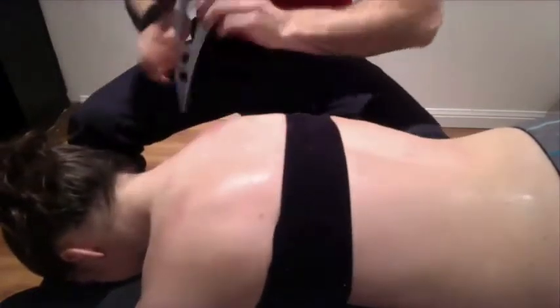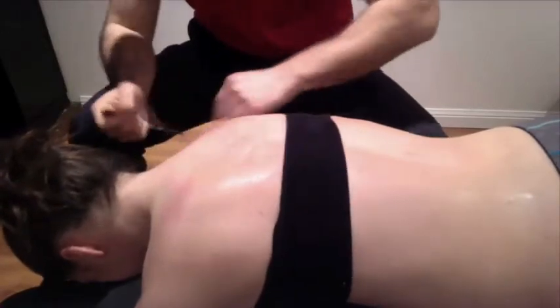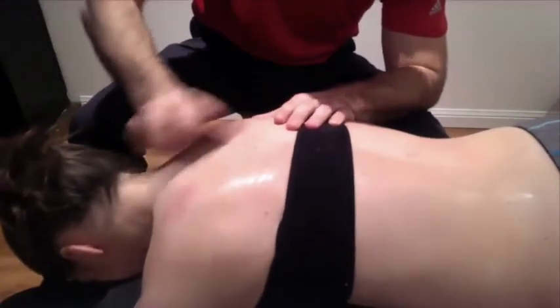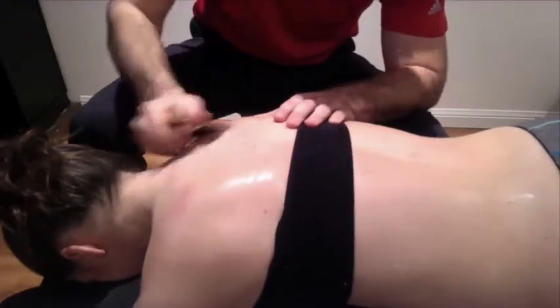Right up in through these traps and levators, we have a couple of nodules. So we're going to start off very broadly and work through those before we end up getting a little bit deeper. We're still using that number one edge — everything is very superficial.